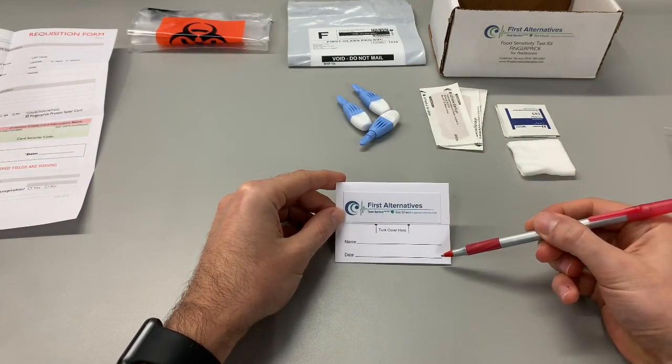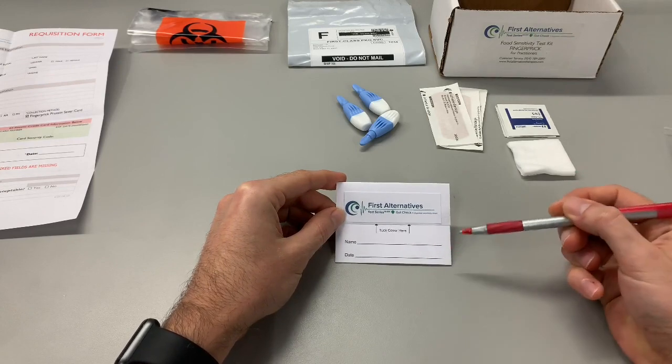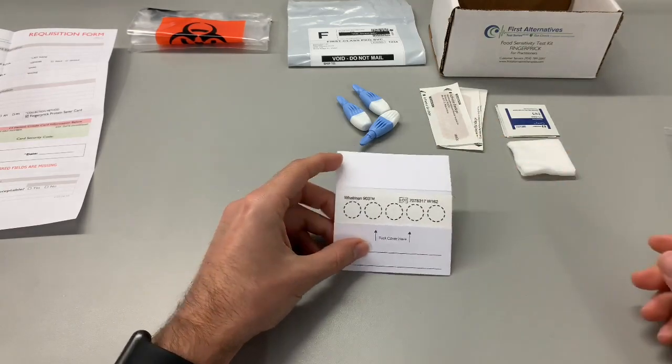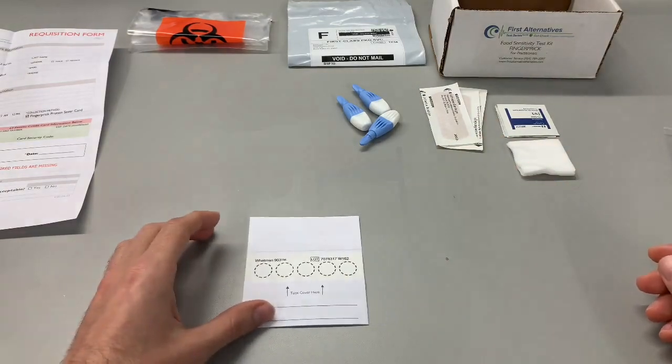Please write your name and date of collection on the protein saver card. Open the flap so that the five circles are exposed. Avoid touching the five circles.